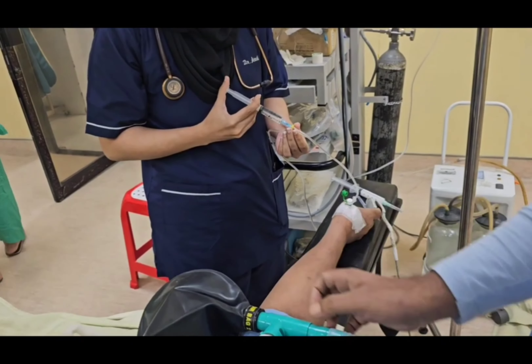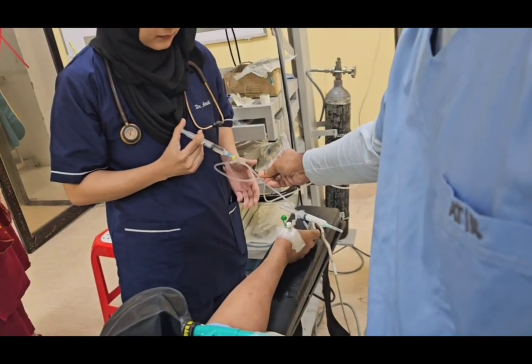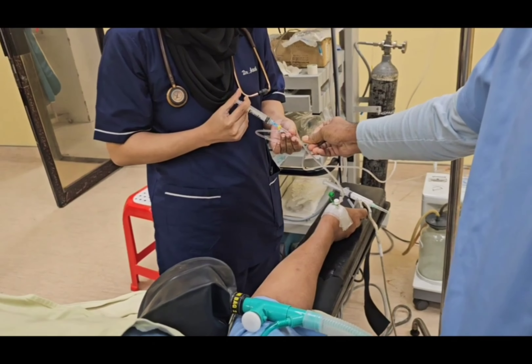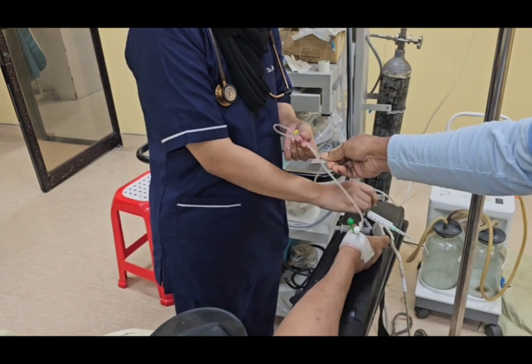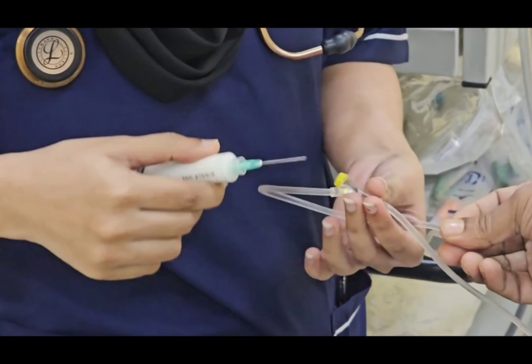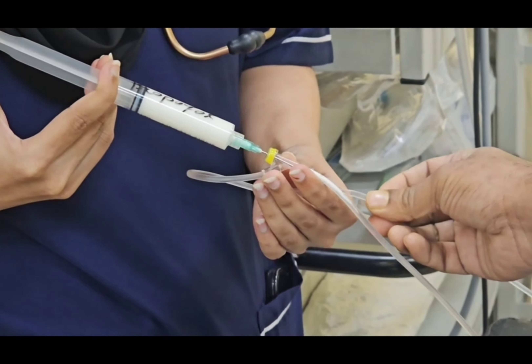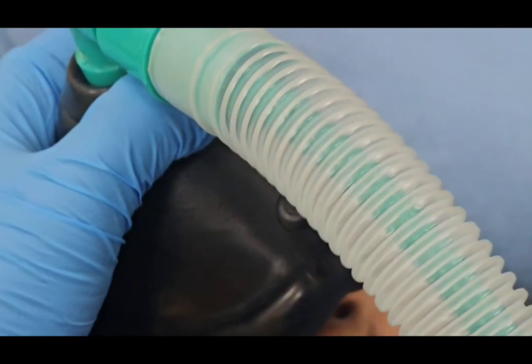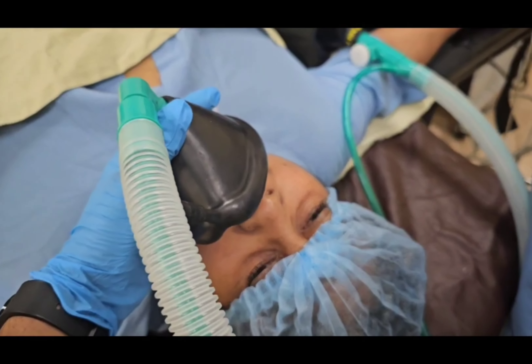Here we are doing induction with fentanyl at 2 micrograms per kg body weight. Propofol will be given after that at 2 mg per kg body weight. We are continuing the pre-oxygenation and giving propofol. We will do the pre-oxygenation for exactly 5 minutes.